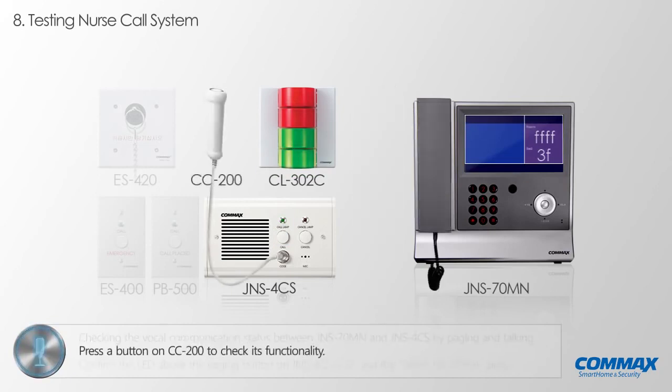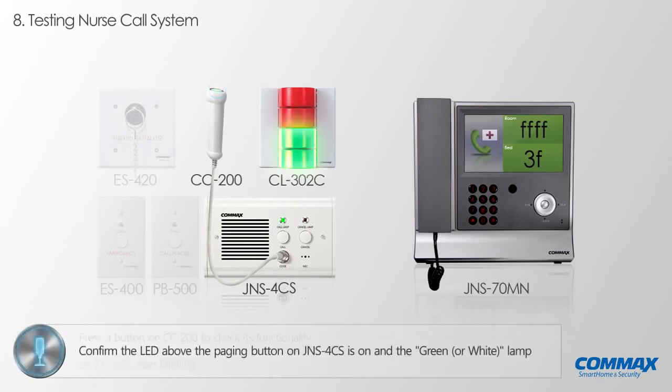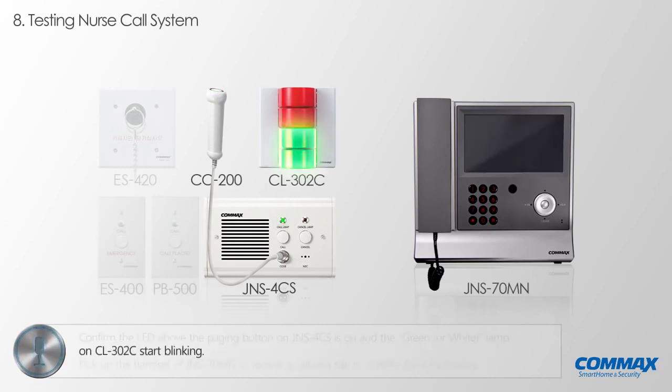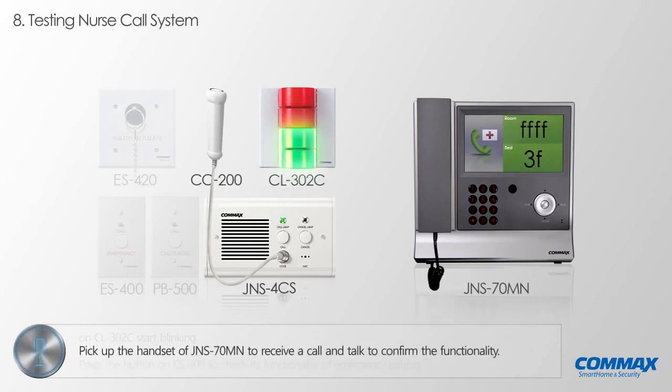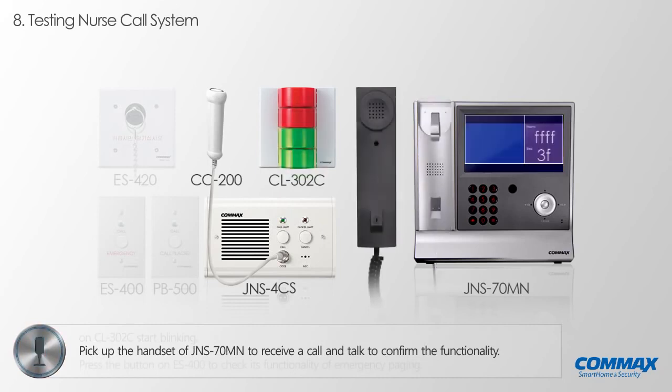Next, press a button on CC200 to check its functionality of paging and calling a nurse call station. Please confirm the LED above the paging button on JNS4CS is on and the green lamp on CL302C starts blinking as the paging button on CC200 is being pressed. And now please pick up the handset of JNS70MN to receive a call and talk to confirm the functionality of CC200.